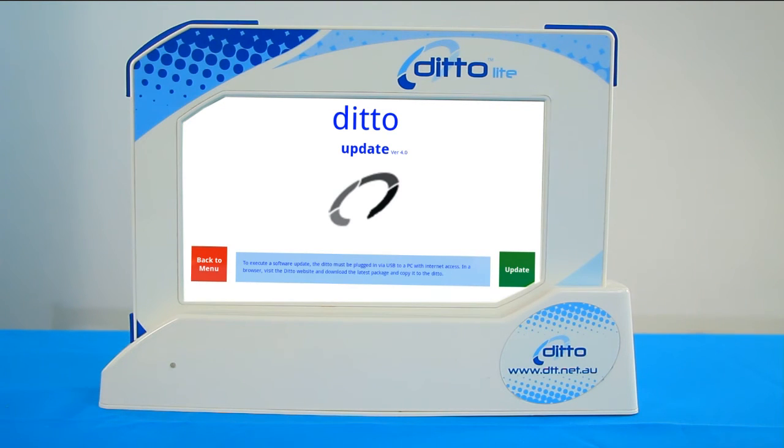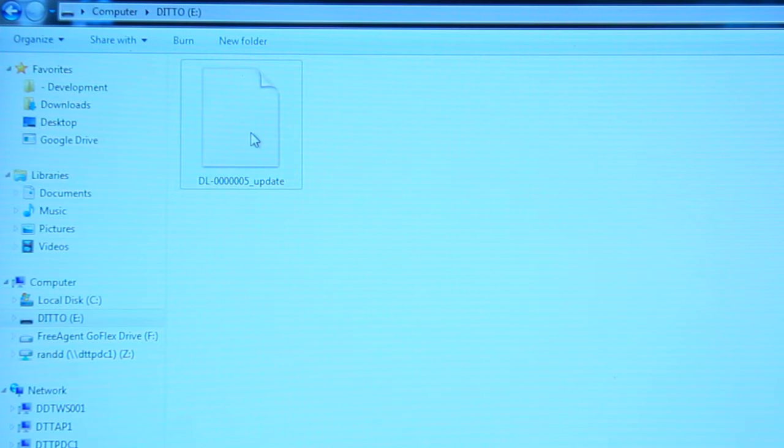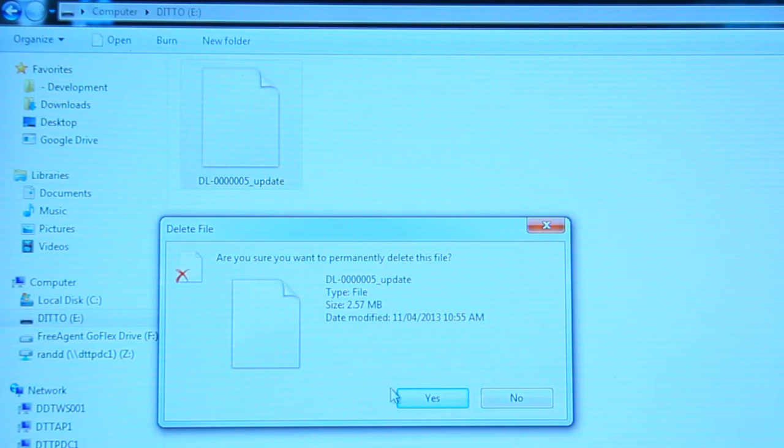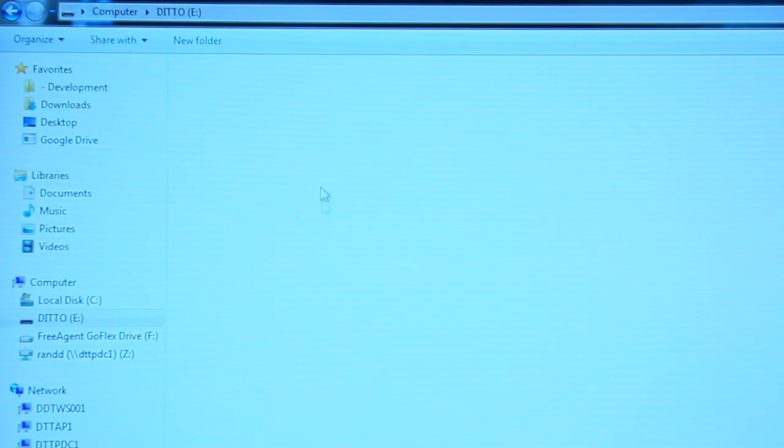The Ditto will appear on the computer as a drive. Delete any existing update files from the Ditto drive and copy the new update file to the same location. Once the file is on the Ditto, the connection between the two devices can be disconnected.